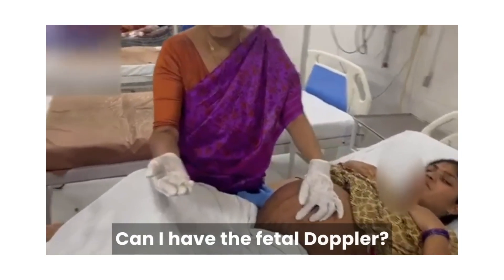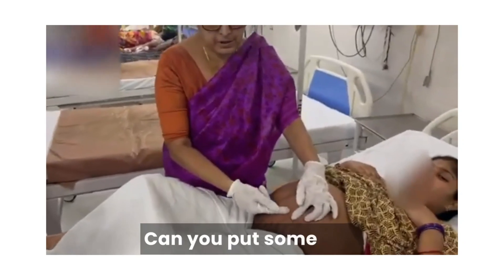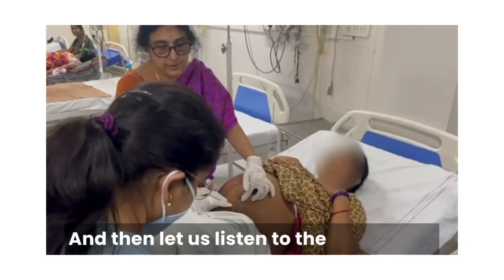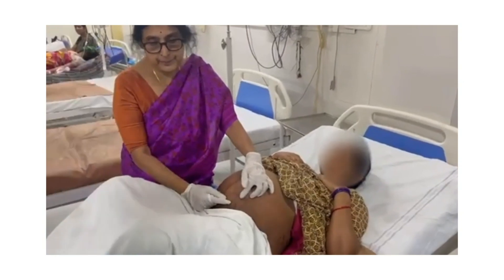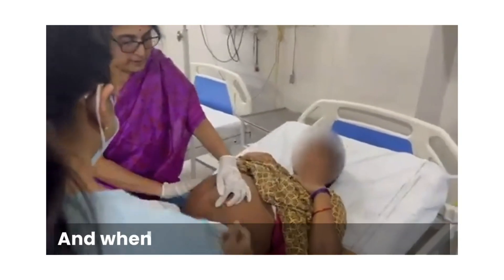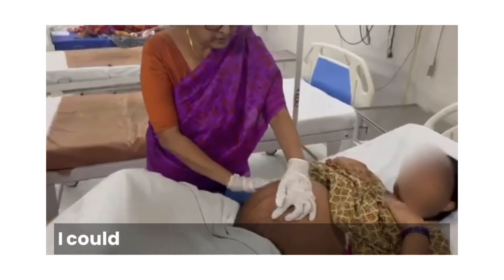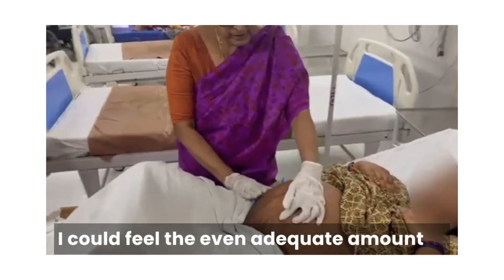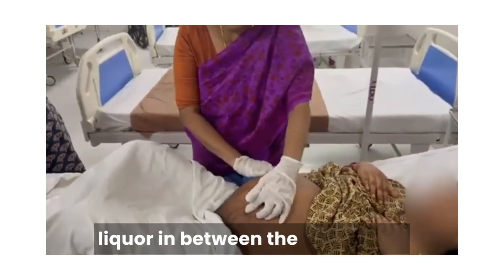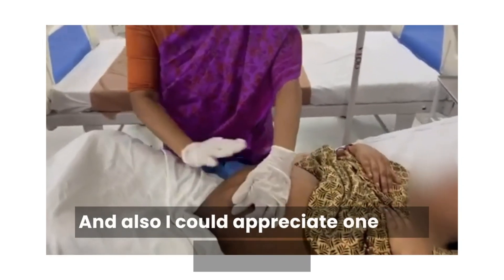Can I have the fetal Doppler? Can you put some gel and then let us listen to the fetal heart. And when I was palpating the fetal parts, I could feel an adequate amount of liquor in between the fetal parts.